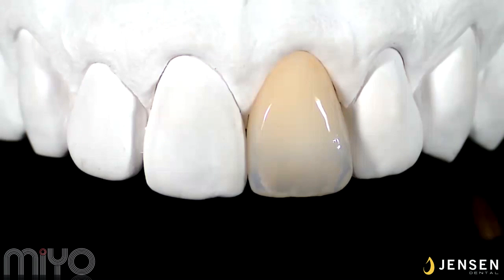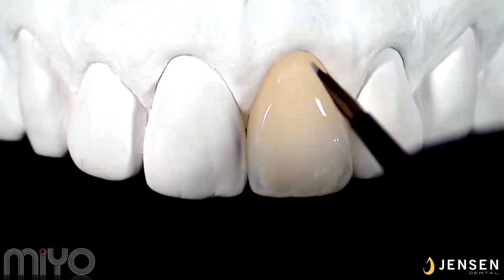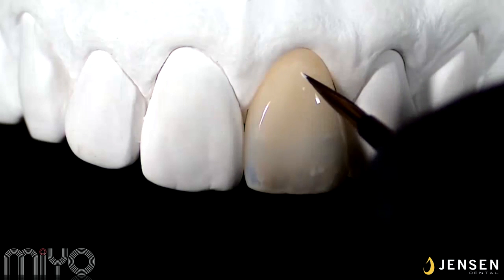Also add some spots for a stronger contrast. Creating a value difference near the border of gingival third and body third region to slightly bump up the contrast and value. You can also add some translucent bands or spots, but be careful not to go too intense. Being subtle is the most important thing next to contrast. Create that subtle barrier and add spots to achieve the depth that you're looking for. You can also add crack lines with ease without mixing colors. All the extra colors are added with contrast effects in mind.